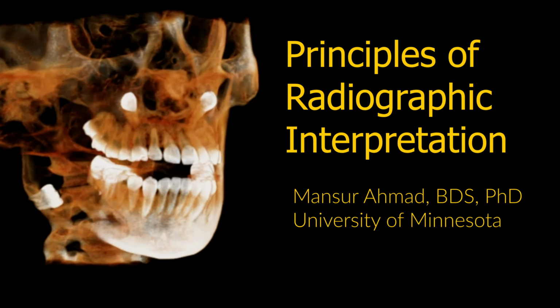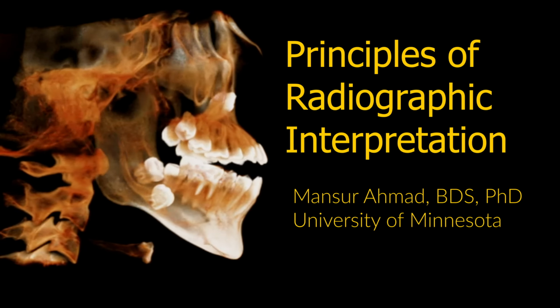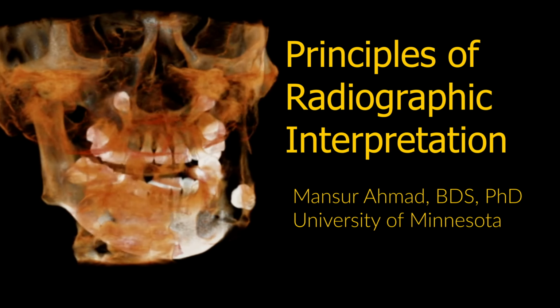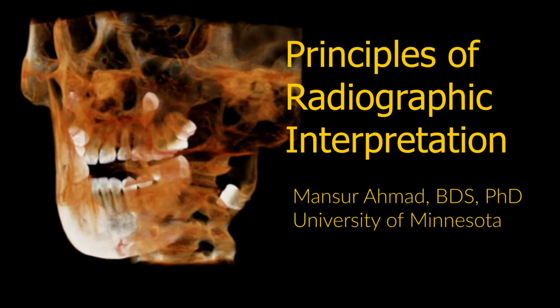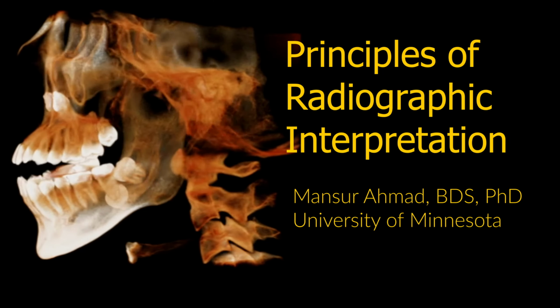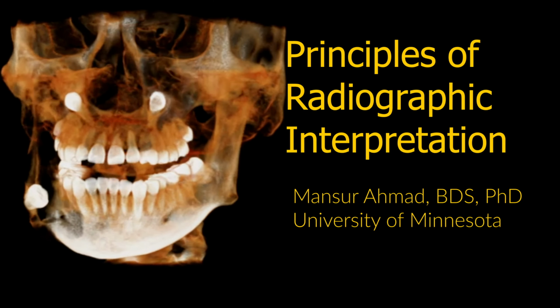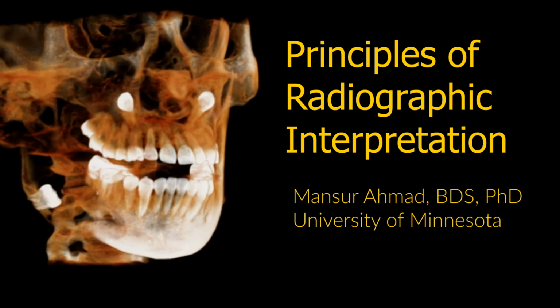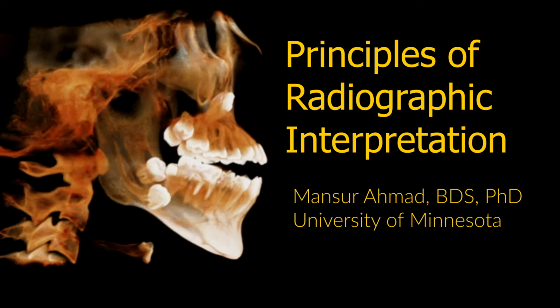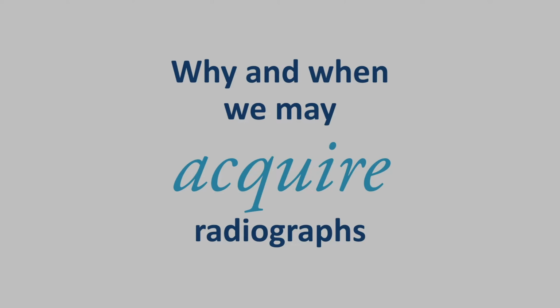Hello everyone. In this video, we are going to learn about the principles of radiographic interpretation. Radiographs are important tools in the diagnostic process. Each radiograph contains a lot of information about the health and the disease of the patient. If we are careful enough and follow a systematic approach, we'll be able to harvest all the information available on the radiograph. We'll reach a good differential diagnosis. This will help us prepare a better treatment plan and help our patients. So without much delay, let's proceed.